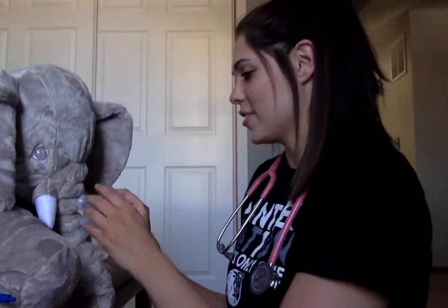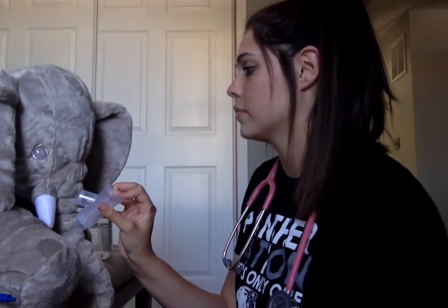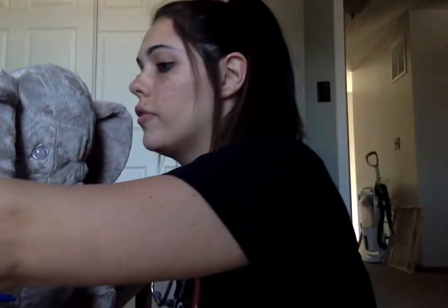First you're going to shake this. Then you're going to seal your lips around it. As I push, you're going to inhale. Then hold for 10 seconds, or as long as you can. And then exhale completely. Perfect. So after all those, I'm going to check your breath sounds again and take your vitals.